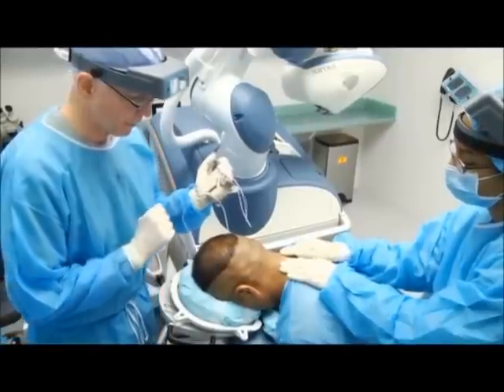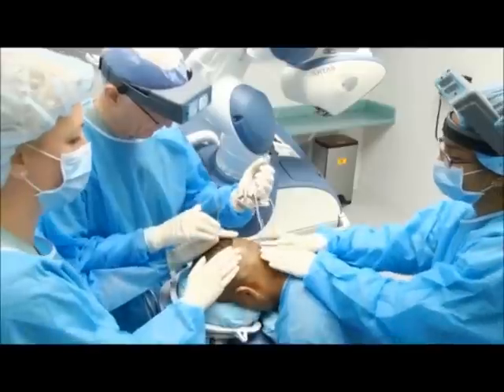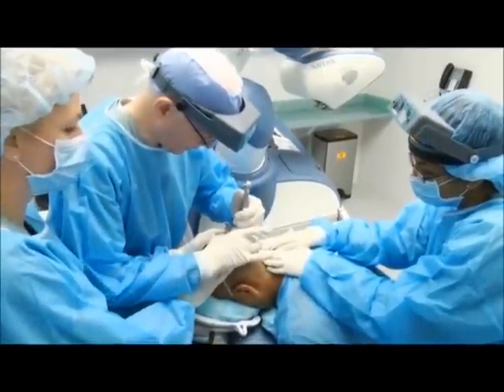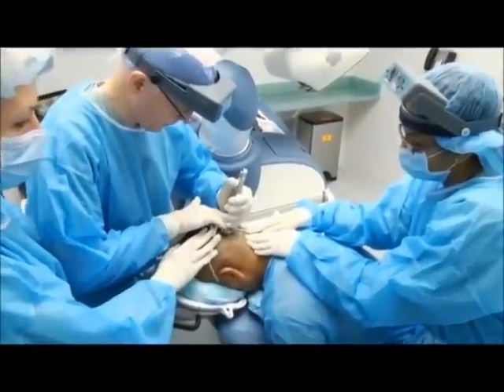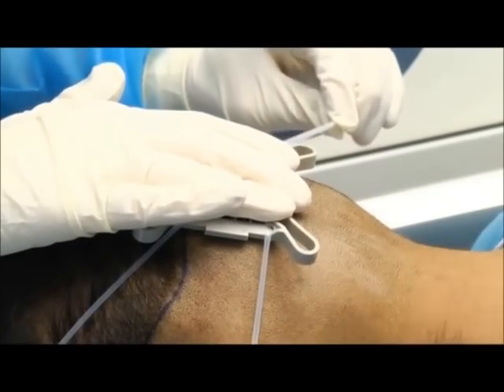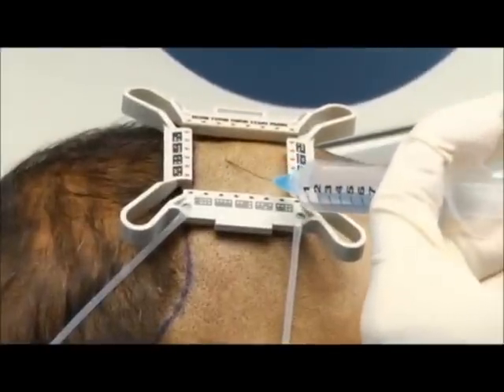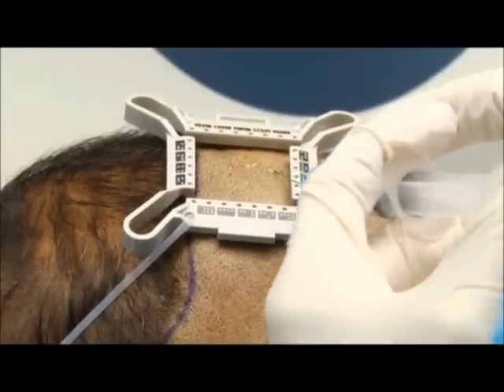The first step is to use four-corner traction and stretch the scalp. We're going to put this at the uppermost portion of the field that we're going to be harvesting. We put the tensor in place, put our hand down, and then use the elastic to keep it in position. I use a little bit of tumescent fluid in the very superficial dermis, which gives the skin a little bit more stability.